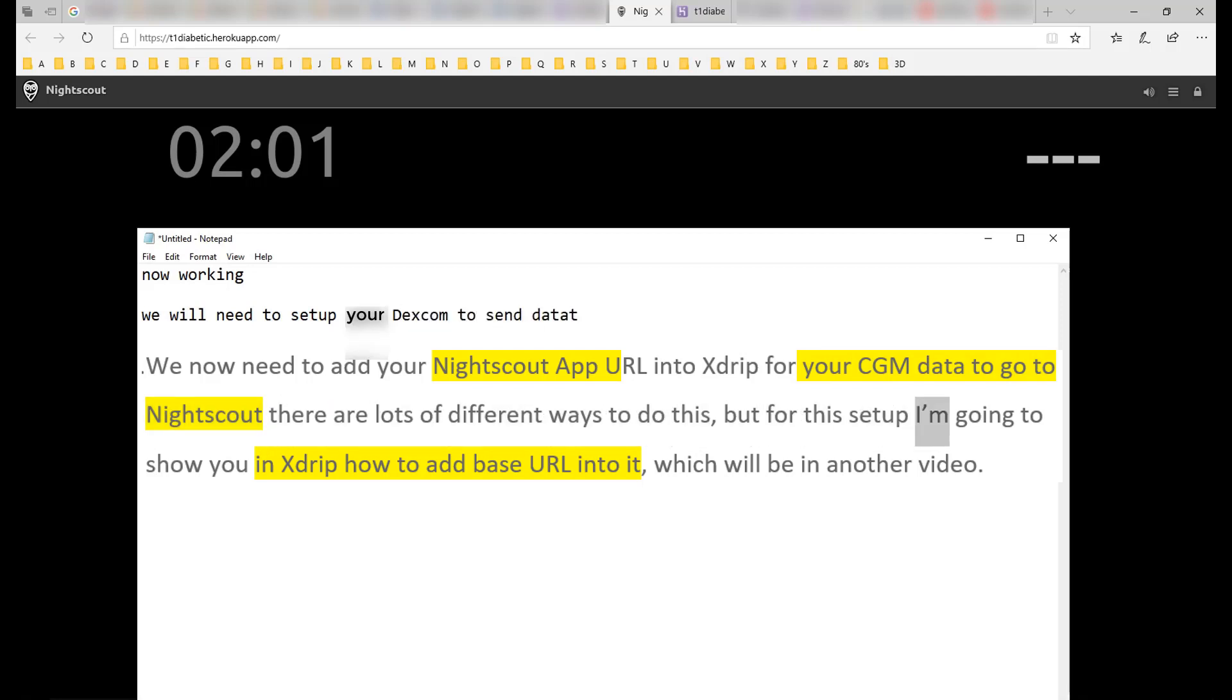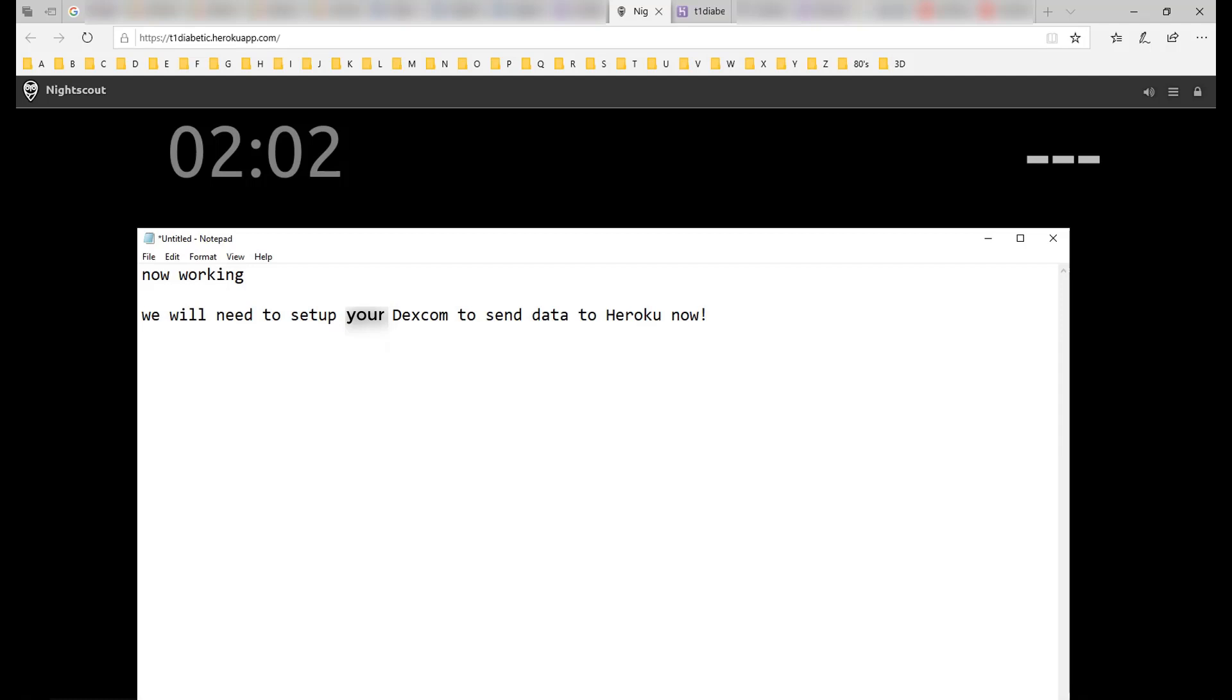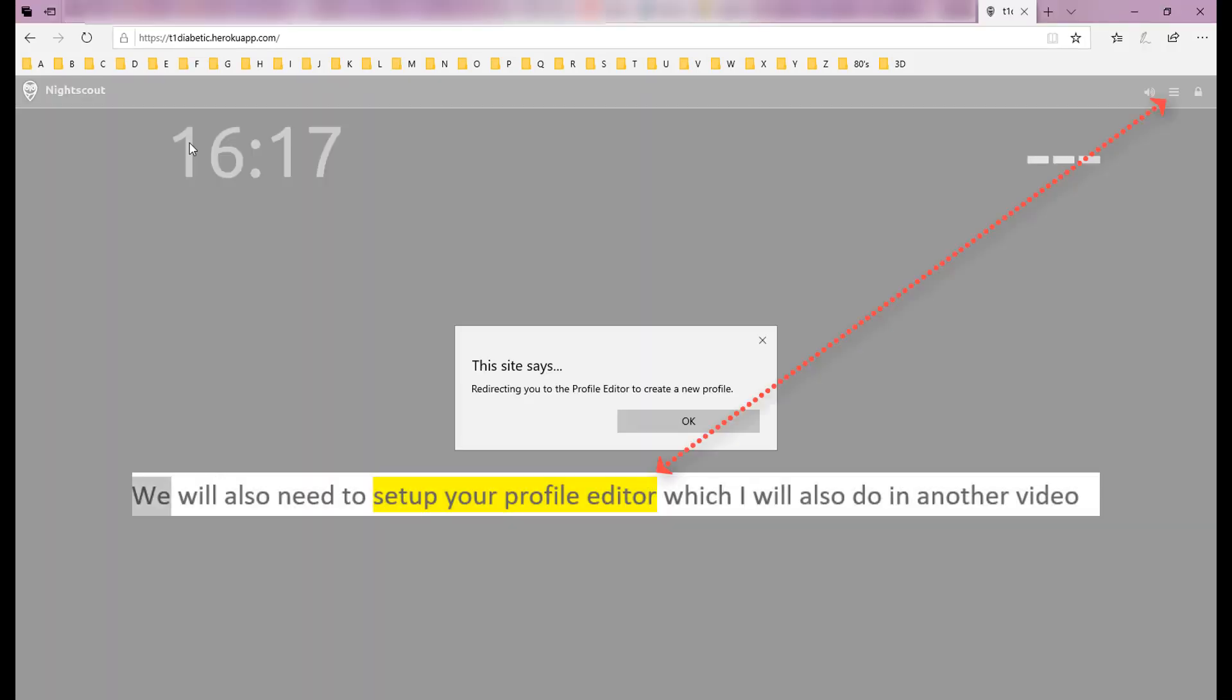But for this setup I'm going to show you in xDrip how to add base URL into it, which will be in another video. We will also need to set up your profile editor which I will also do in another video.